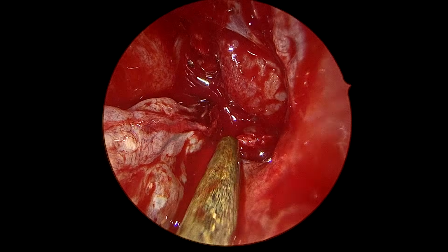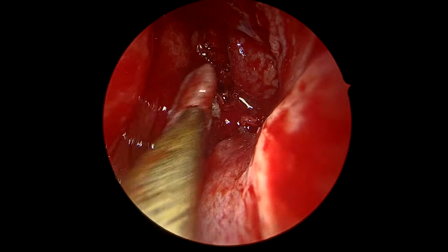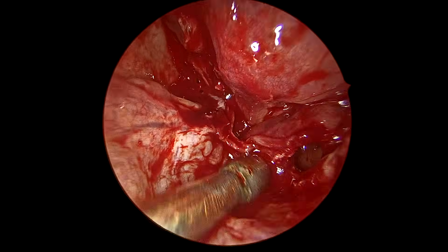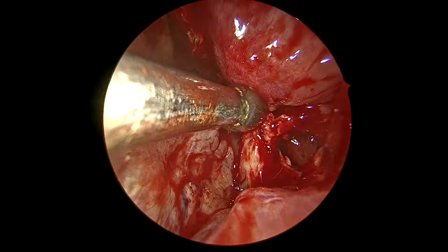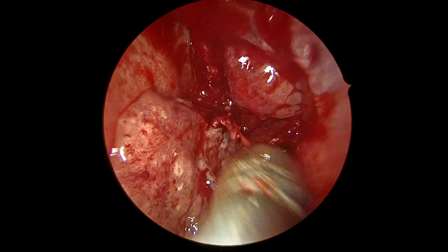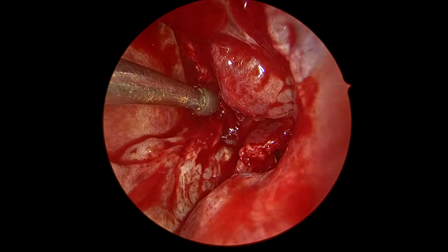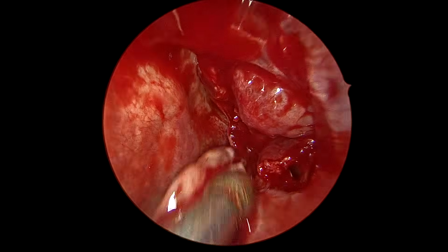Right now I'm just trying to understand where the origin of the mass is, and you can see there is some amount of bleeding as well. It happens when you resect the middle turbinate and do the uncinectomy. Now I'm entering the maxillary sinus. You can see the glimpse of the maxillary sinus, where my suction is going in, the hollow structure inside. This mass is attached mostly towards the posterior fontanelle, and some thickening is there around the opening of the maxillary sinus also.